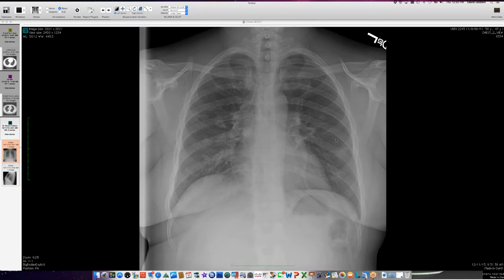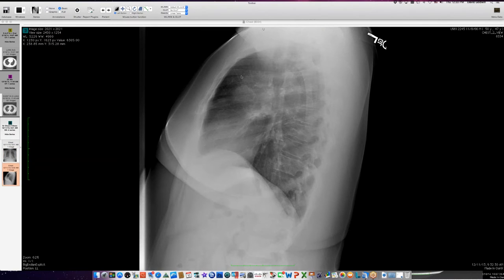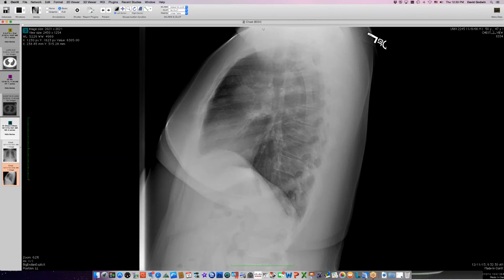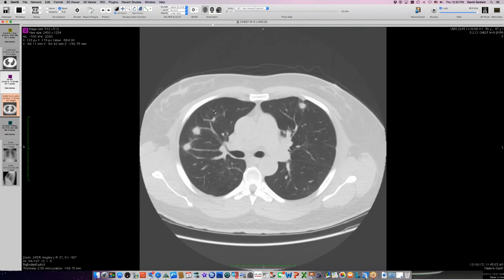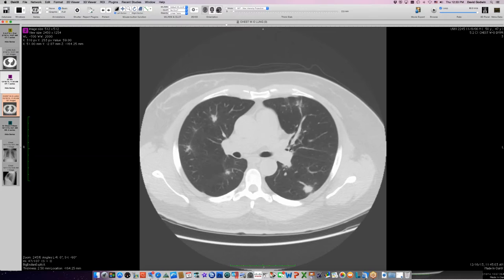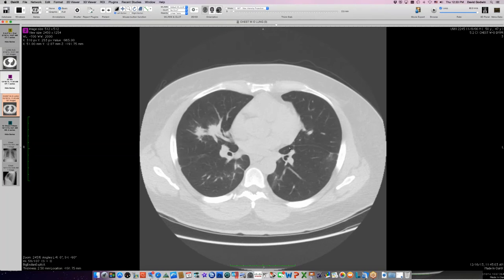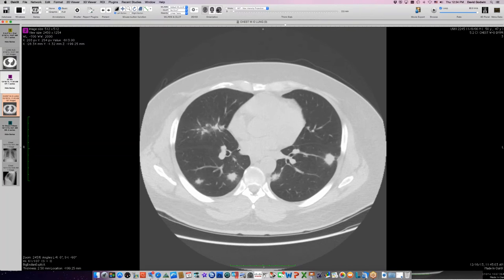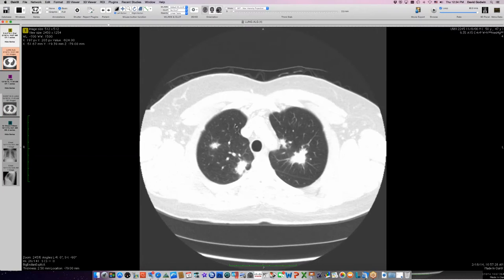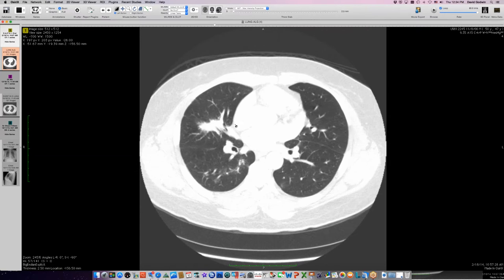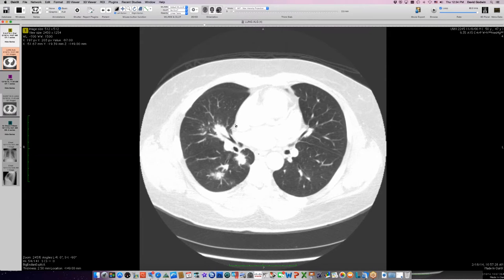This first is a 47-year-old man who has these very vague nodules on chest radiograph. On CT he has these stellate lesions, sort of soft-looking, seeming to be around vessels and airways — not particularly hugging the hilum, but there's some flame-like radiation from the hilum. This is Kaposi's sarcoma — a fellow who'd had HIV detected more than ten years ago but decided not to take his medications. Things got worse over the next month or two, and this CT scan shows larger nodules in the same distribution. He also has skin lesions.